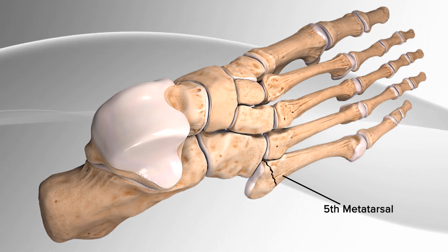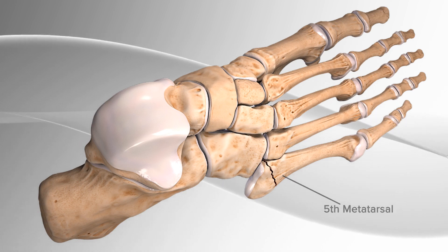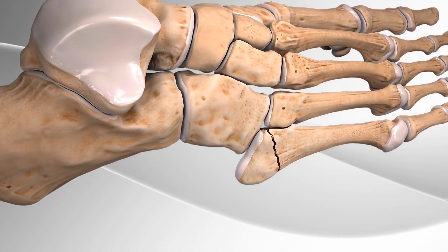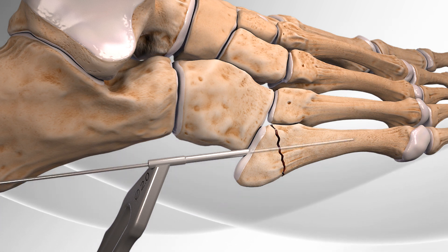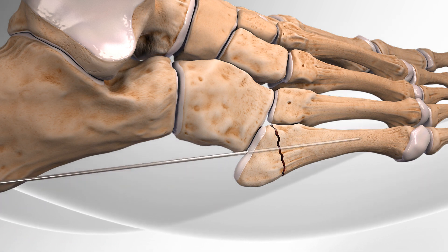The broken bones are held together by using a surgical screw. First, the surgeon makes an opening in the skin and inserts a smooth, stainless steel pin through the base of the bone, just past the fracture line.